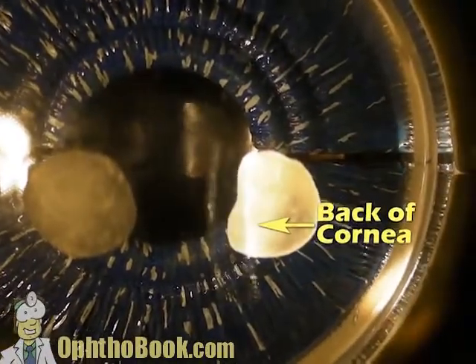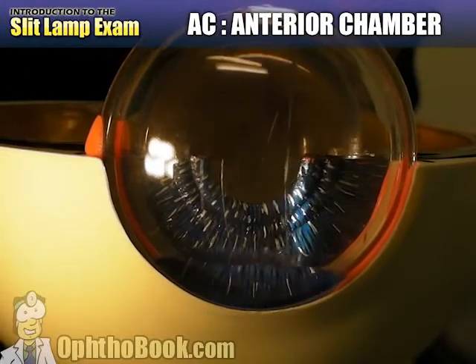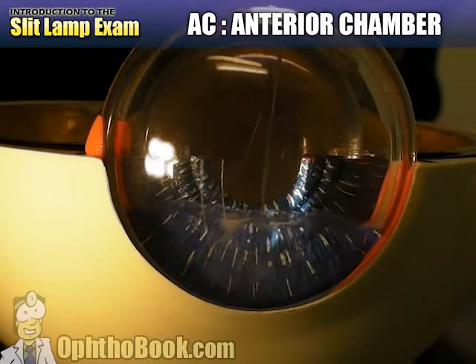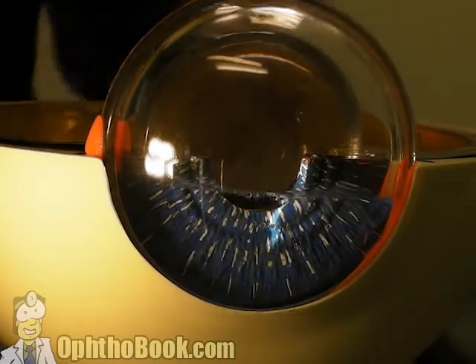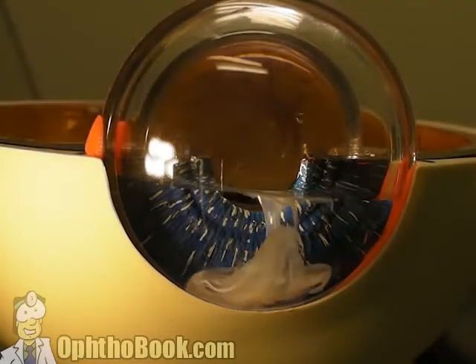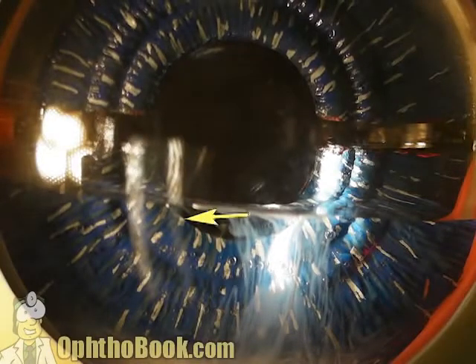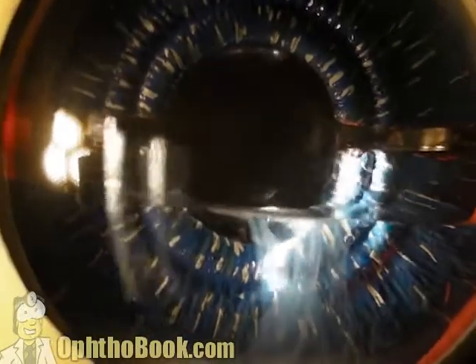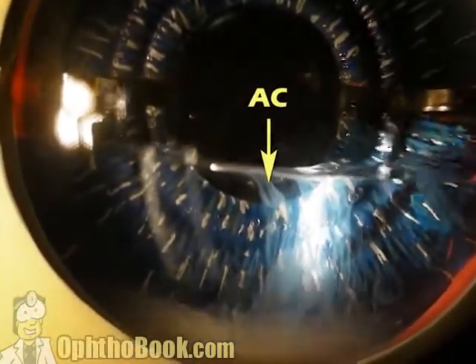Okay, let's move on to the anterior chamber, basically. And that's the fluid-filled space between the back of the cornea and the surface of the iris. I'm going to fill it up with some water here just to make it a little bit easier for us to visualize. And in fact, let's put some inflammatory cells in here as well and just make it a little bit easier to see. And when you're looking at the anterior chamber, I find it helpful to angle my beam so that it strikes the back of the cornea to the left and the iris surface to the right, and using the pupil as a black background, it makes it a lot easier to see things floating in that space.